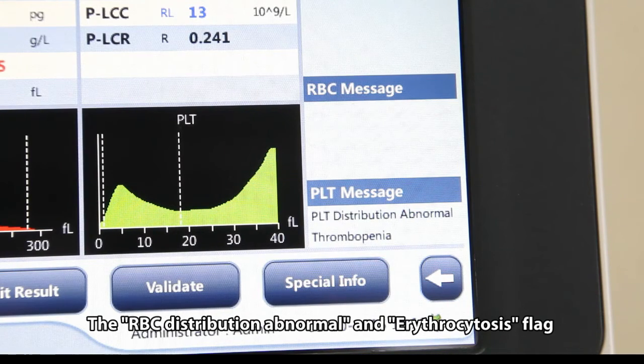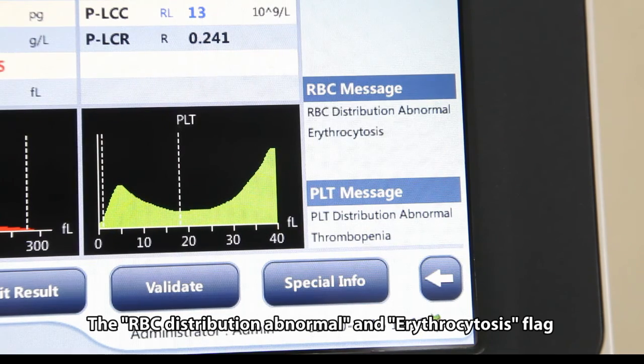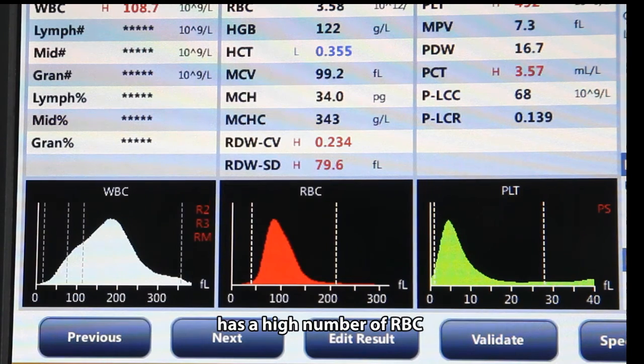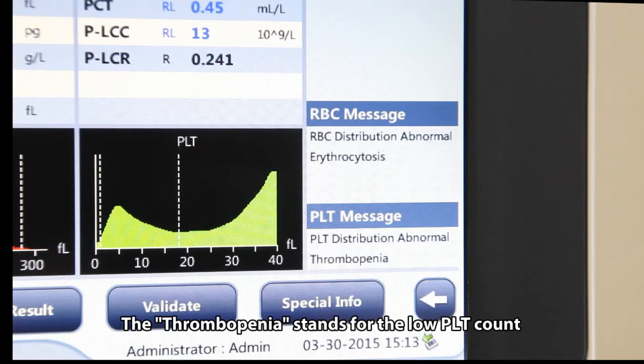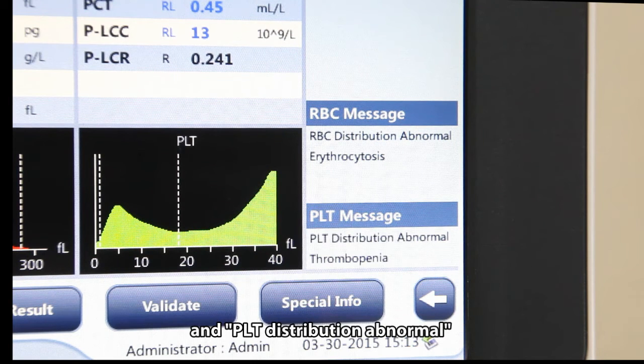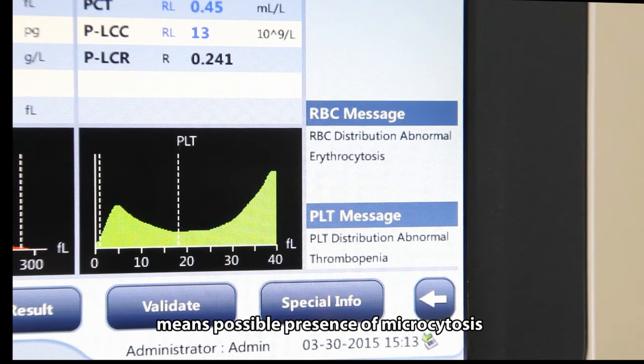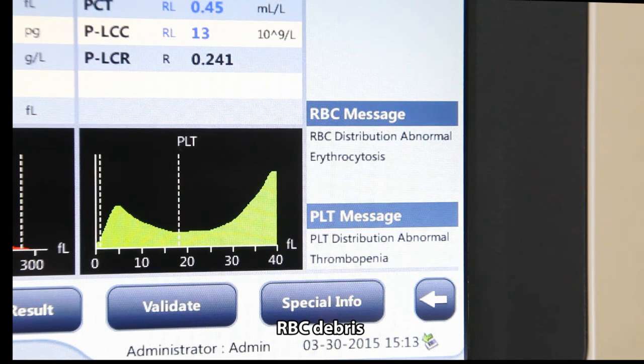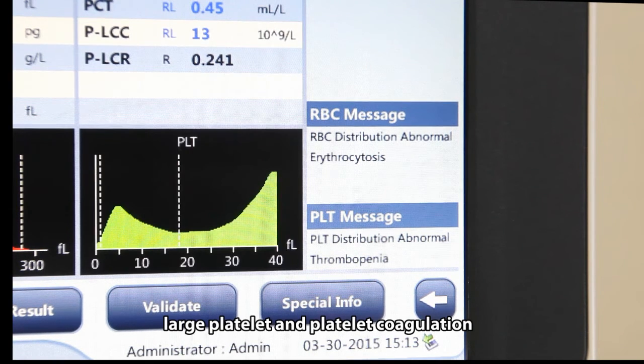The RBC distribution abnormal and Erythrocytosis flag represent either signs of abnormal RBC present or sample has a high number of RBC. The thrombopenia stands for low PLT count and PLT distribution abnormal means possible presence of microcytosis, RBC debris, large platelet, and platelet coagulation.